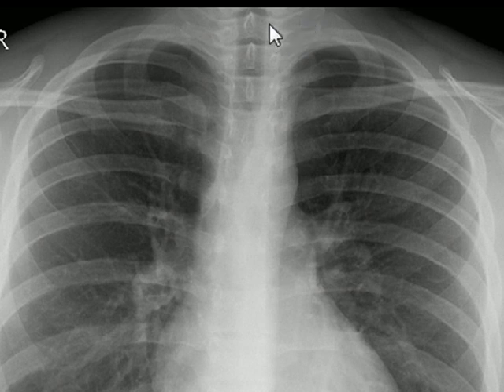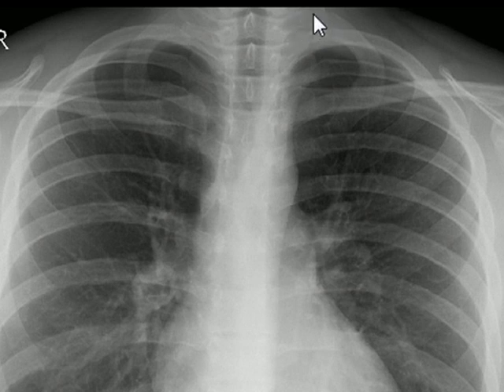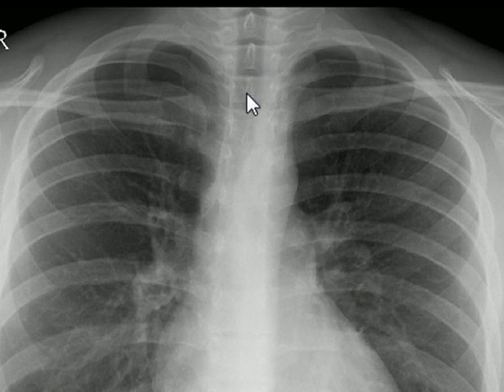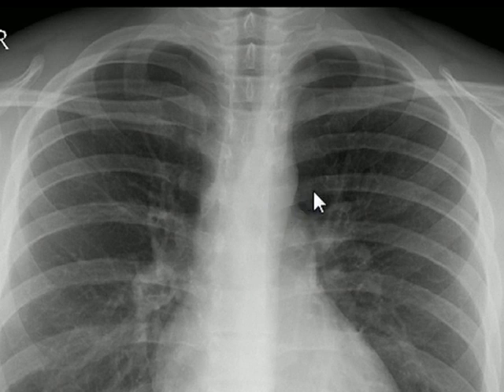This is the first thoracic vertebra. The first rib is attached to the first thoracic vertebra. These two structures are transverse processes, and these peg-like structures are spinous processes. So: first, second, third, fourth, fifth thoracic vertebra, and fifth rib. This is the sixth rib and sixth thoracic vertebra at the level of bifurcation of the trachea.